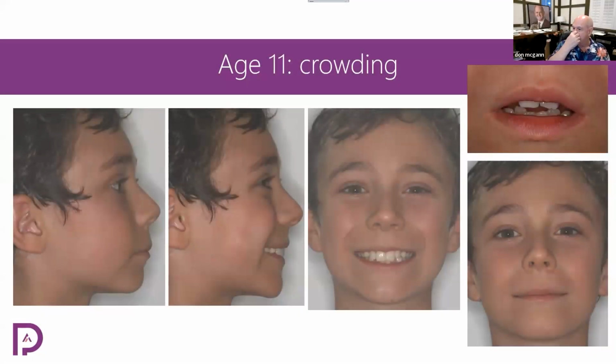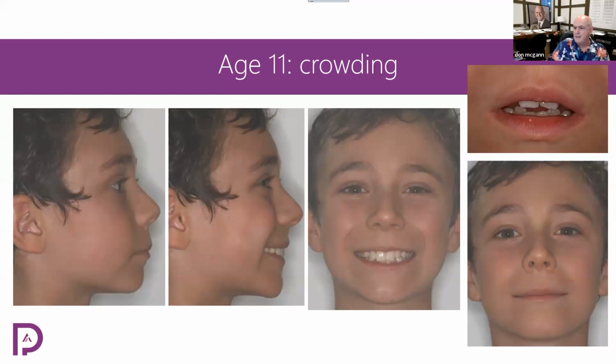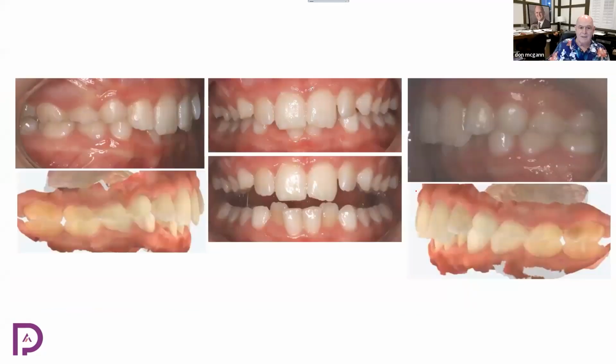So this is an 11-year-old boy, so we're talking something a little later in the mixed dentition. And then the next case will go much earlier in the mixed dentition. And this is just the basic part of it. This is not every case situation that we see, but you can see that Dr. Hisham makes some nice records here. He's got the resting lip, the resting upper lip, which tells me that the vertical is fairly good. We have a little bit of deep bite, probably caused somewhat by over extrusion of the upper incisor a little bit, and over extrusion of the lower incisor. Okay, so 11-year-old boy, mixed dentition. We got blocked out lower lateral incisors and deep bite.